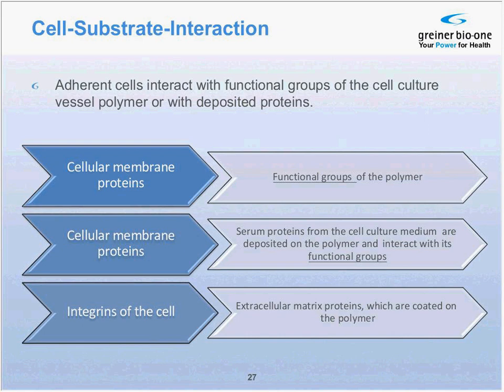Adherent cells can interact with their integrin receptors, for example, or with their proteoglycans with any cell culture vessels. The first stage of cell attachment would be that the functional groups of the polymer interact with the proteoglycans, which is an electrostatic attraction, followed by interaction of the integrins with serum proteins that cover the polystyrene vessel.